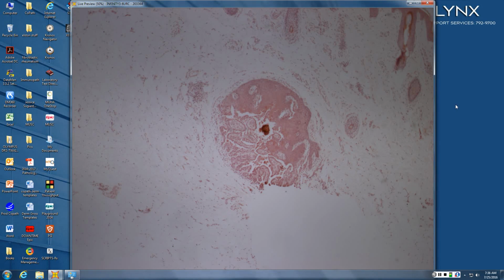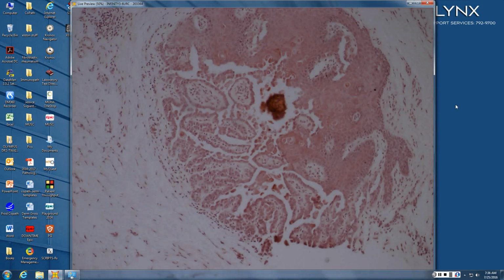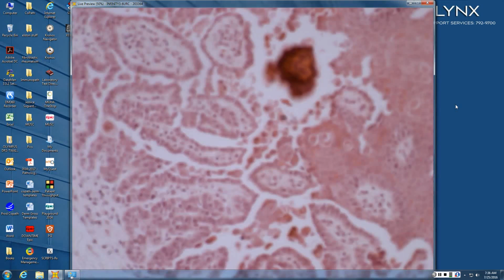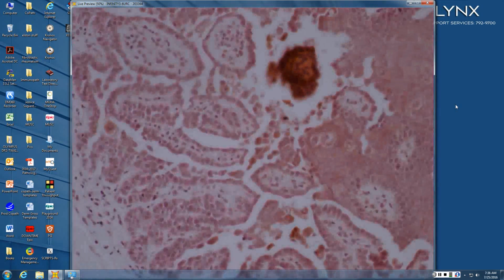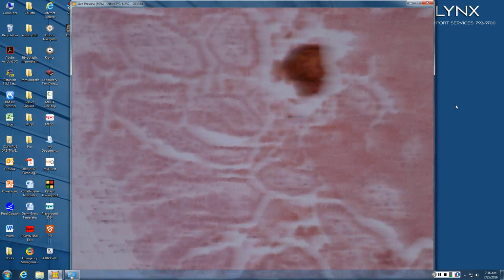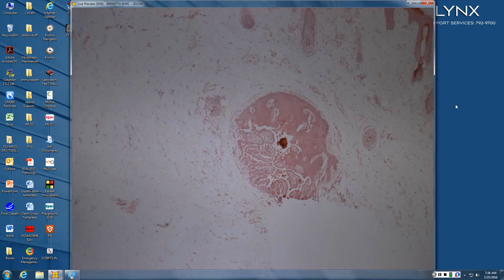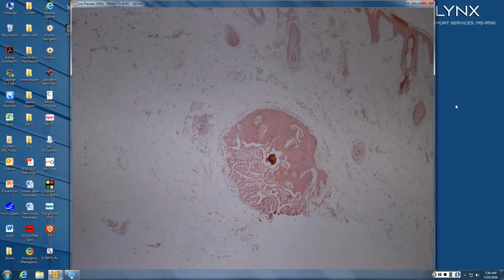And then you've got villi, and what else do you have besides the villi? I would imagine some corps ronds and grains. Like lots of little corps ronds and grains. So what would that suggest? A warty dyskeratoma. Why does this one not connect to the surface? Just plain a section. Okay. Right, which is real life.